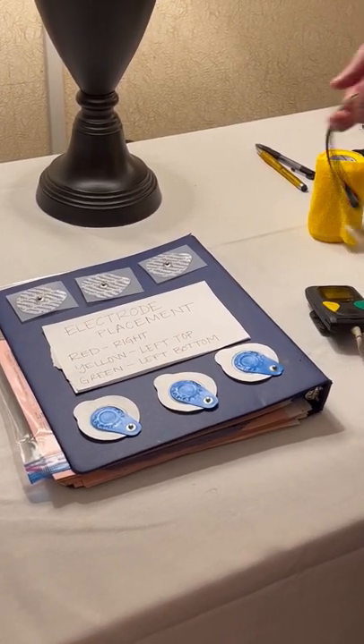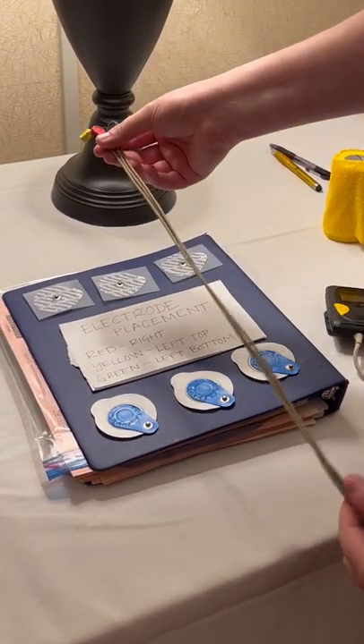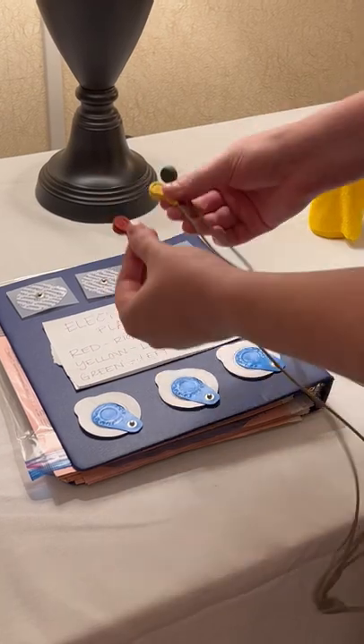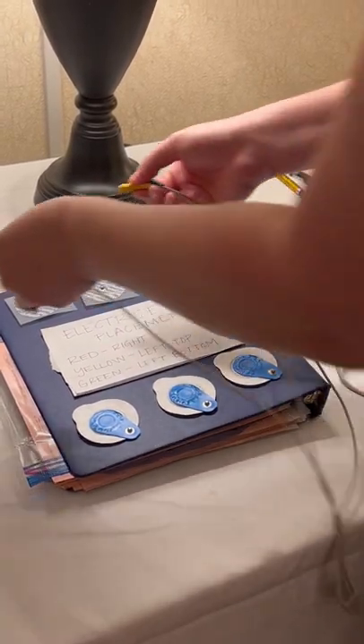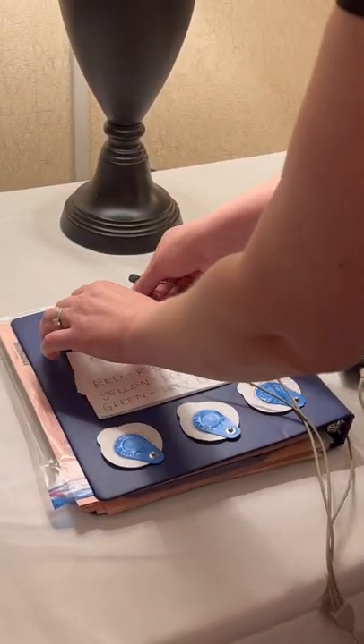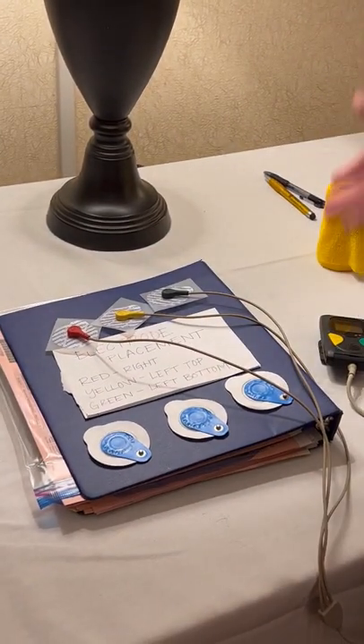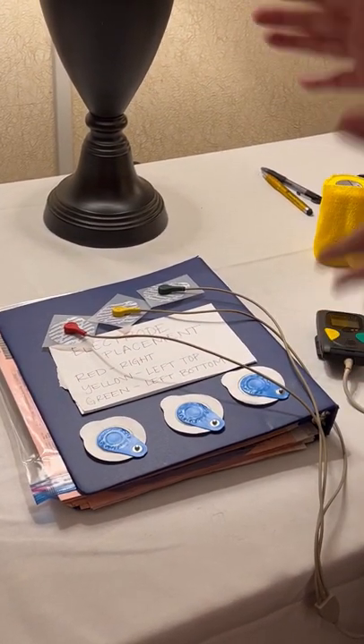These are the three leads. These cords have a miraculous ability to tangle themselves up no matter how straight you keep them, so just try to do your best. My advice is to attach the leads to the electrodes before you attach the electrodes to the dog — it'll go much smoother and you don't have to push on their ribs.